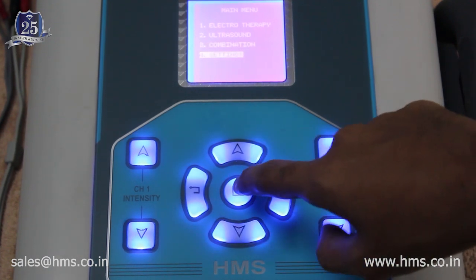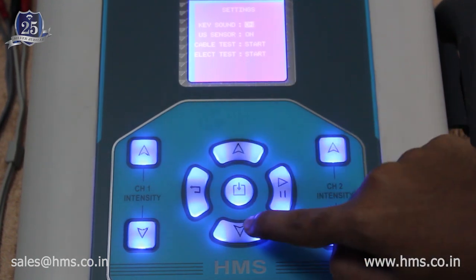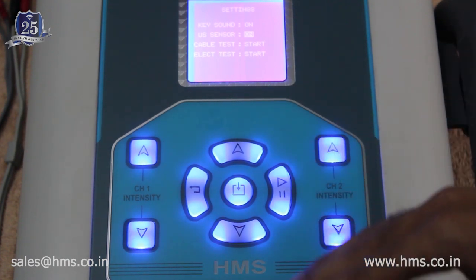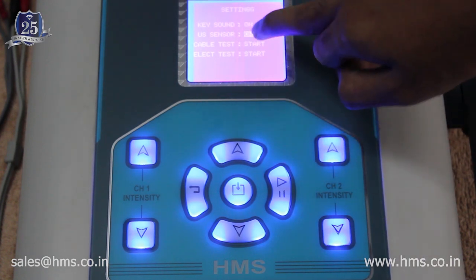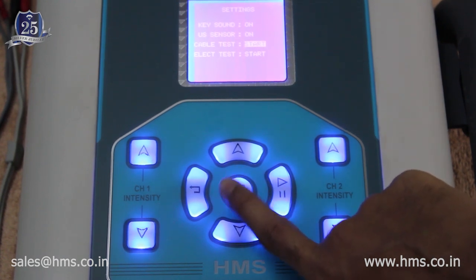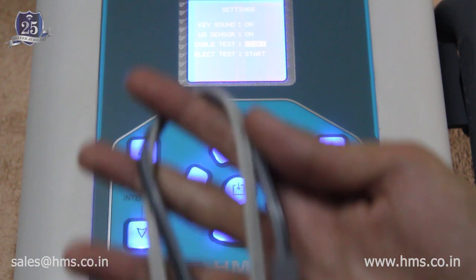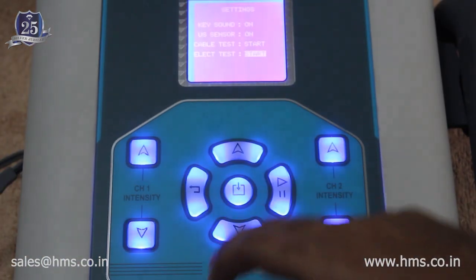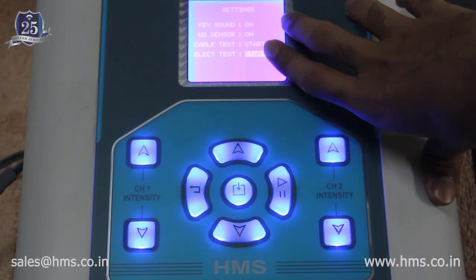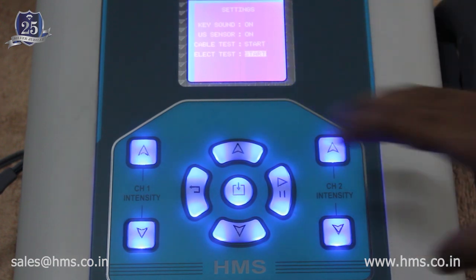In the settings menu, the buzzer sound can be turned on or off, and the ultrasound transducer auto-sensing feature can be enabled or disabled. There is also a cable test feature that lets you verify whether your cables are intact and in good condition without any wear and tear. Additionally, an electrode test feature allows anyone — without engineering knowledge — to check whether the electrodes are functioning properly.